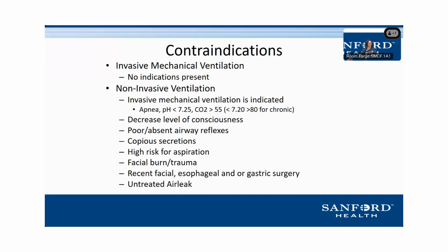Non-invasive ventilation, there are quite a few contraindications to non-invasive ventilation, and our trauma patients may fit into one of these categories here.